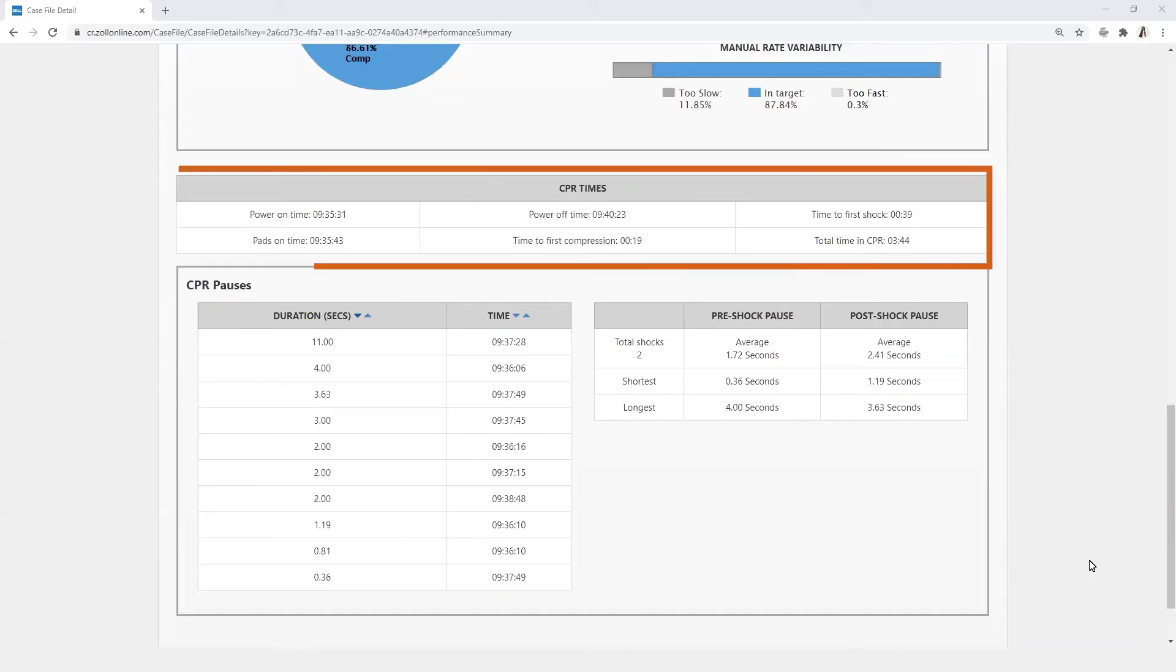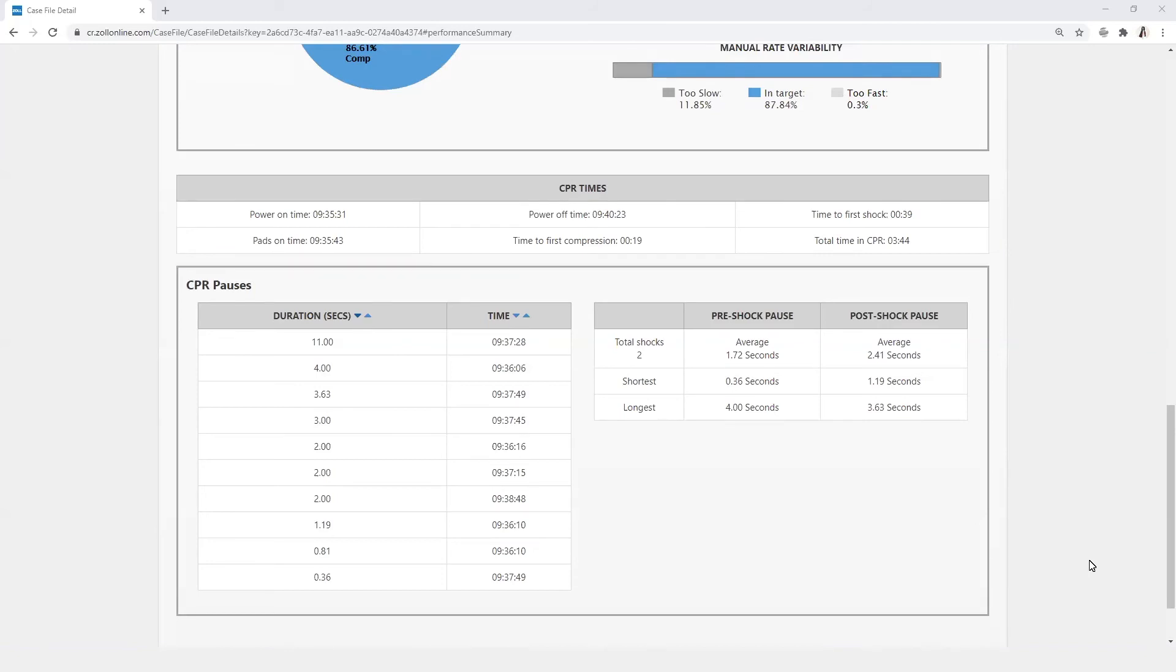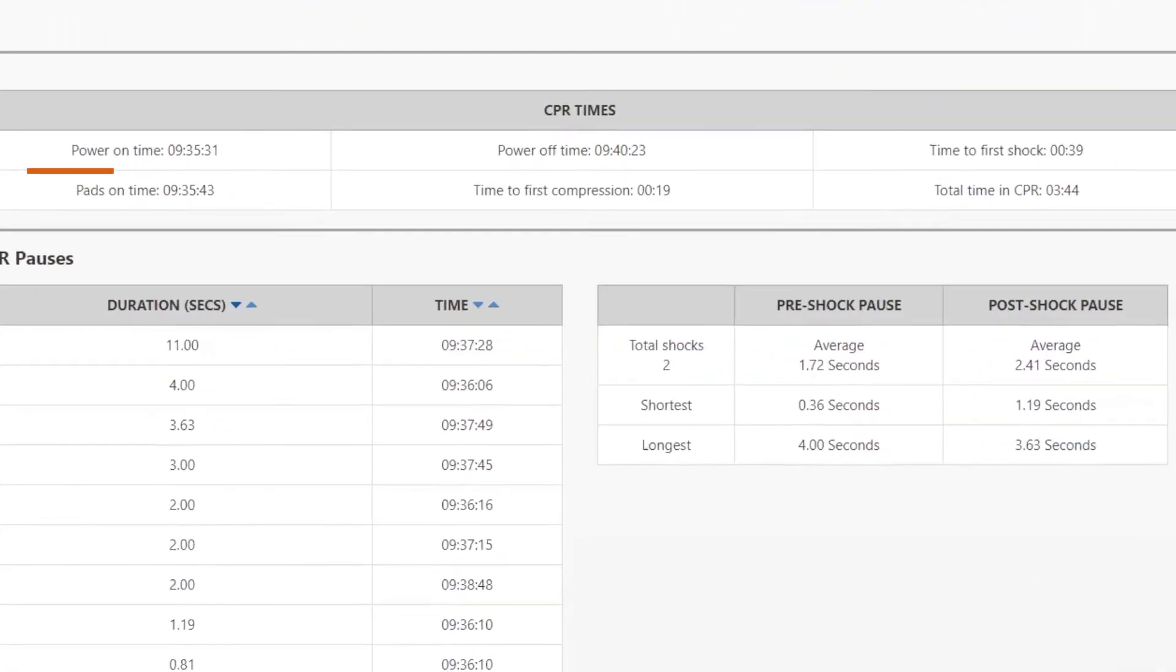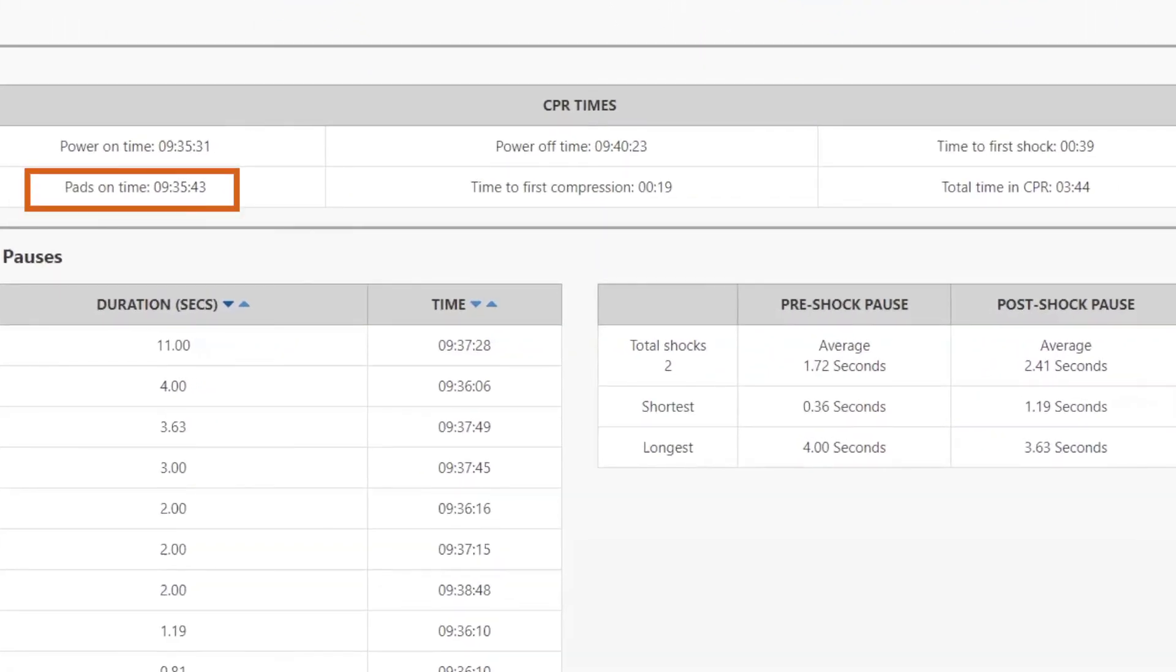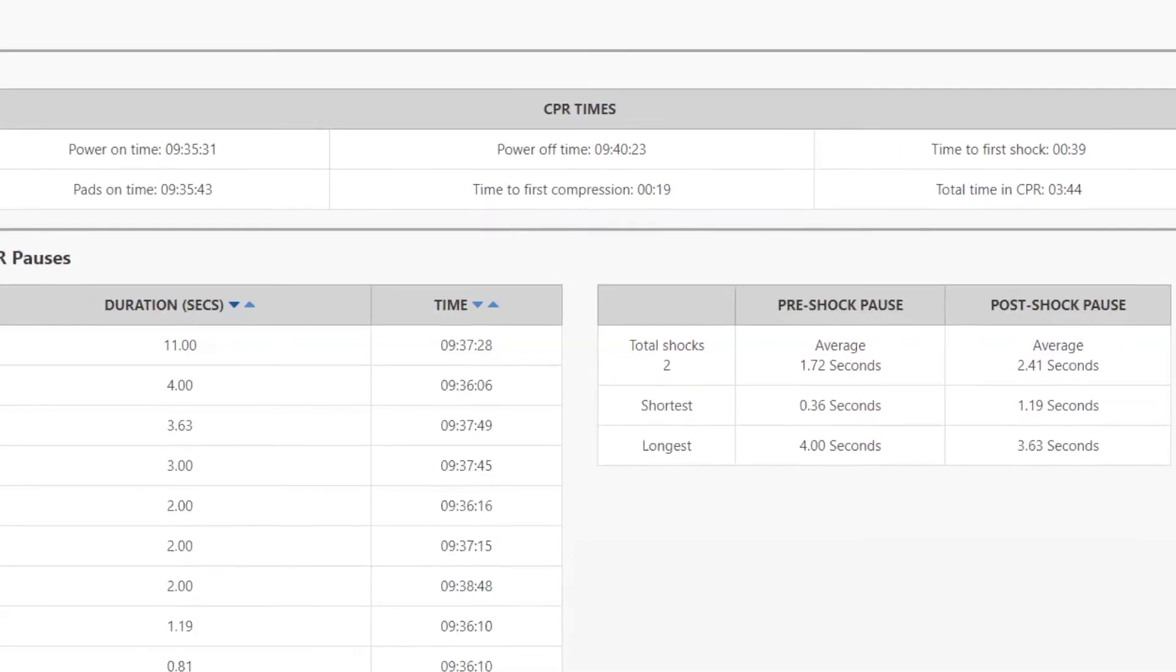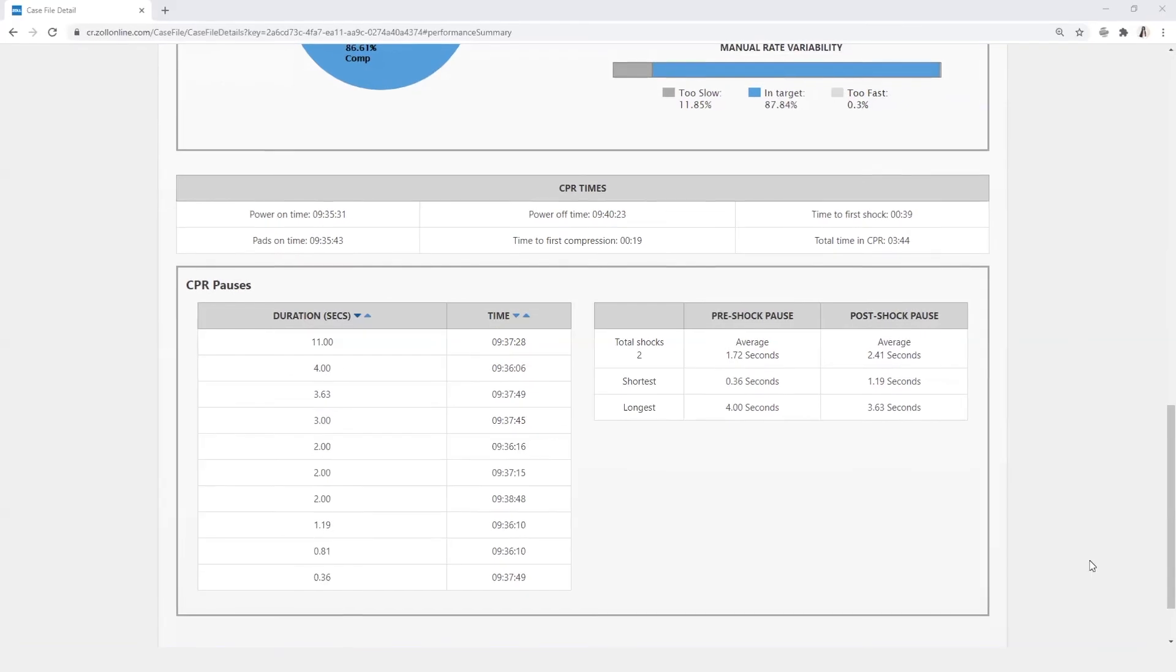CPR times include the times transmitted from the device from power on time to power off time. Pads on time, time to first compression, and time to first shock are calculated from the power on time. Times are displayed according to the clock configured on the device.